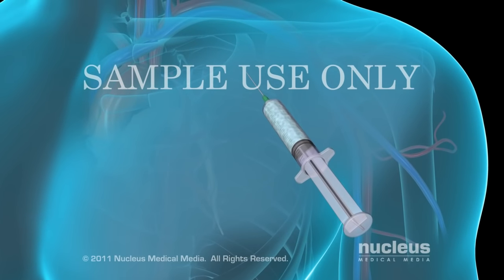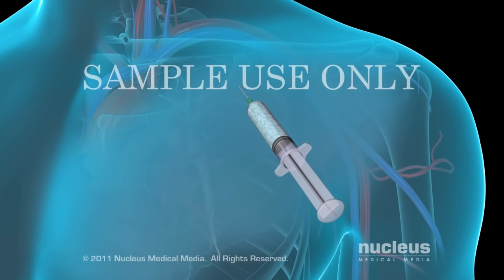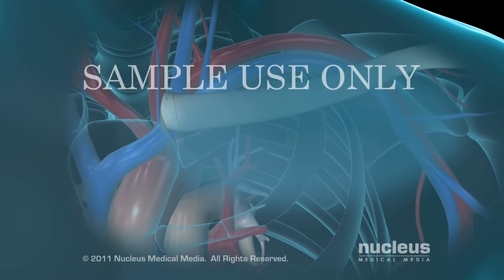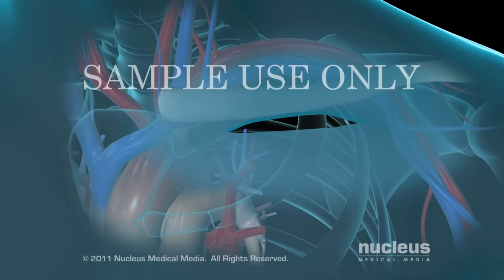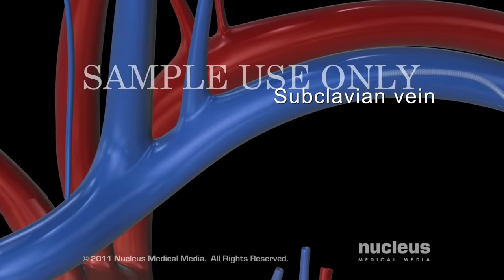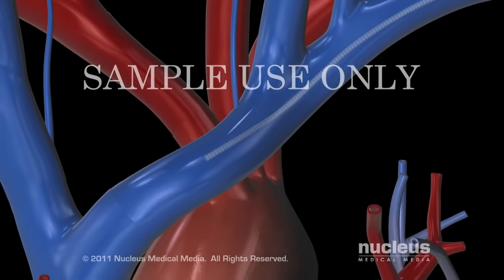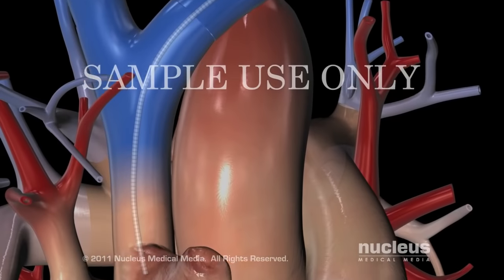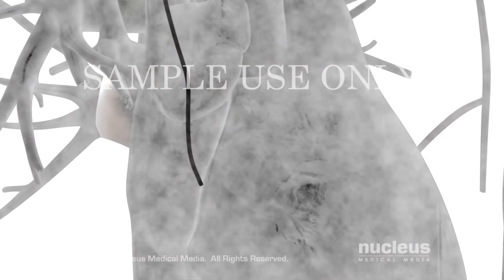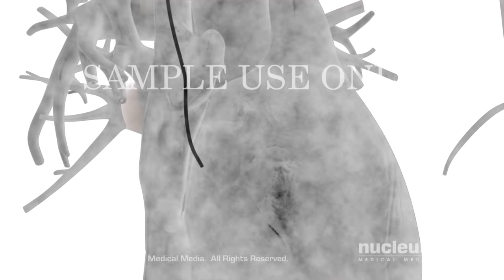A local anesthetic will be injected into your skin to numb the area where the pacemaker will be inserted. The surgeon will make a small incision beneath your collarbone. The pacemaker's leads will be inserted into the subclavian vein and threaded toward your heart until they reach the right atrium. Your surgeon will view X-ray images on a video screen to position the leads correctly.